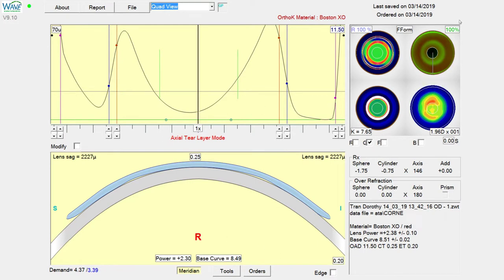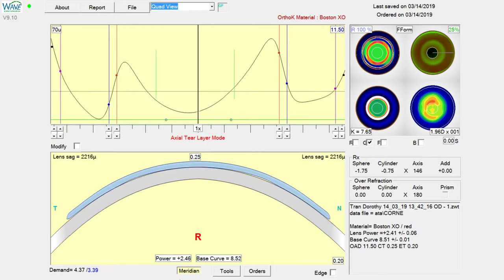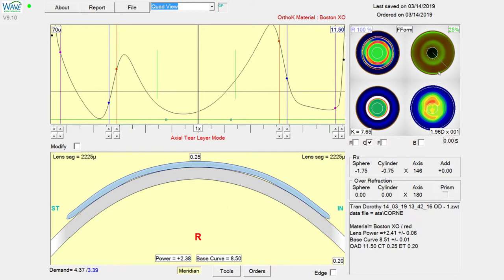I think we can touch that up a little bit, so here we'll click up maybe a couple times. At 2.42 we're a little bit closer to this 2.46 power, so even in this mode we can go up a little bit.